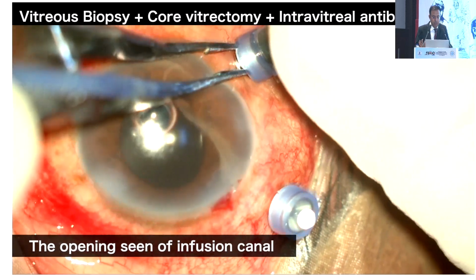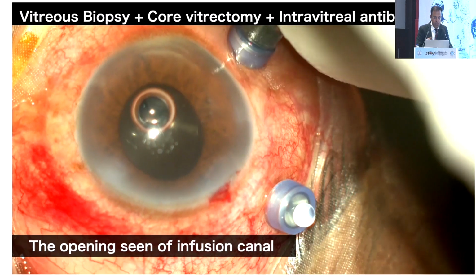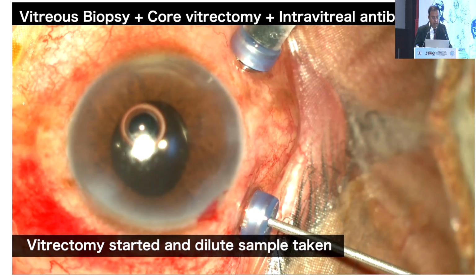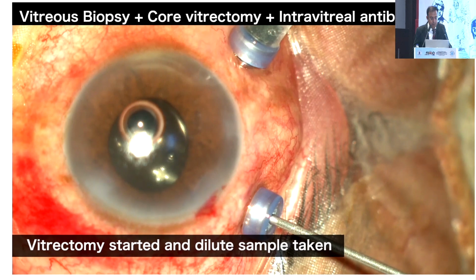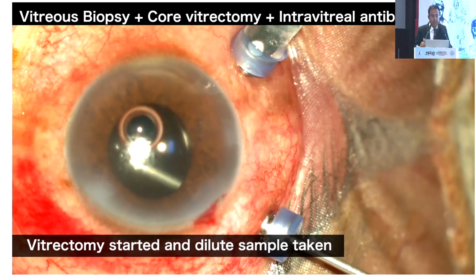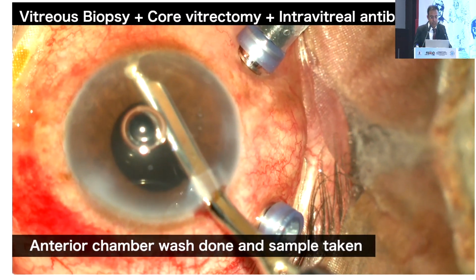Now I'm putting the infusion cannula. Now looking inside the eye just to see the opening. First, I'm taking out the undiluted sample. Then I start the vitrectomy, take out a dilute sample. Now, these 2 things are very, very important because that will aid us in the diagnosis and the treatment further up. Now, I'm doing an AC wash.